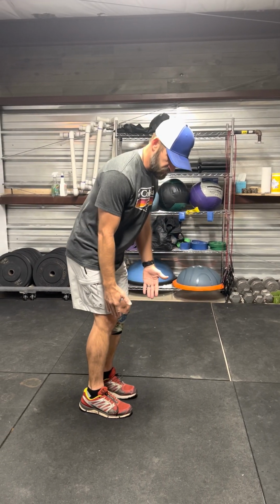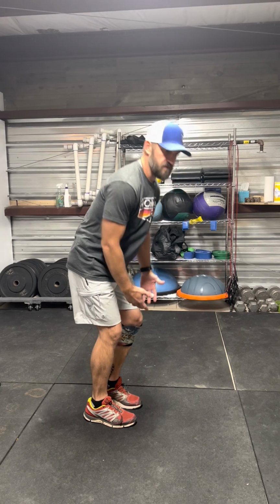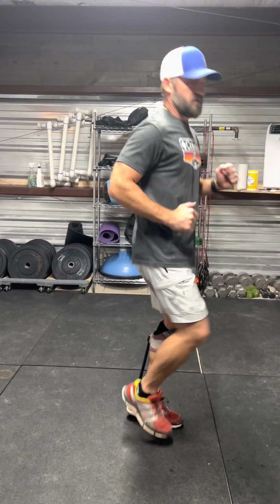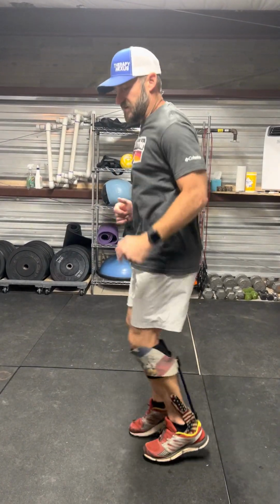Let's see, anything else, Hillary? Talk about symmetry. Oh, and that's the biggest key. When you take smaller steps, it causes you to be more symmetrical. Like I said, your uninvolved side should mimic your other side. Now, some of you obviously have two devices, but if sometimes you have more, it might be easier. And yeah, it is easier, because patients would complain a lot about trying to keep that foot the same as the other one, and the guys with the device on each side, they'd be able to keep it really easy because they're stuck in that. So whenever you're running, you want to land on that forefoot the same way that you land on the forefoot on this side.